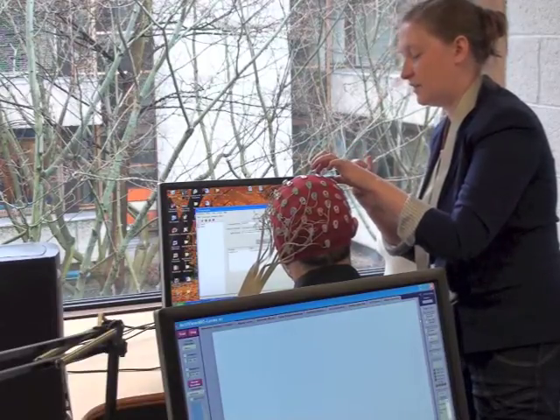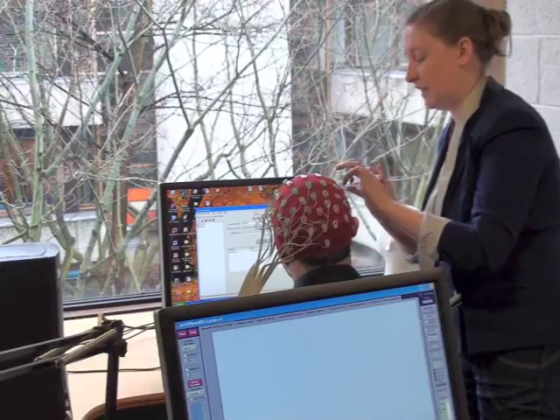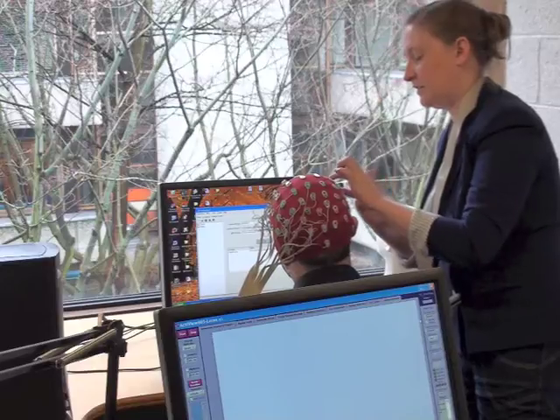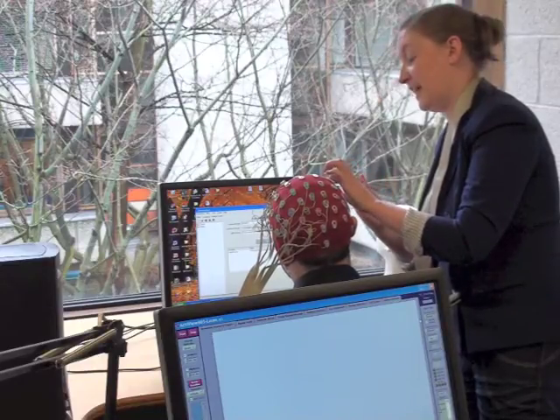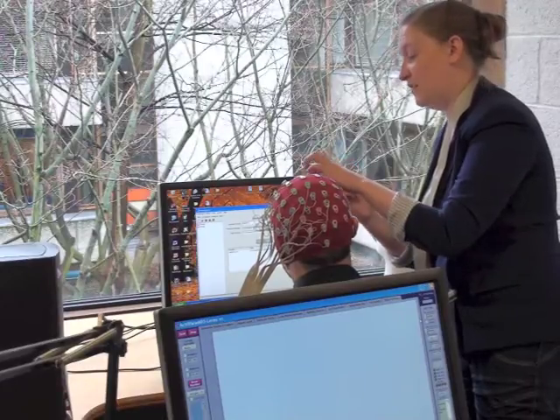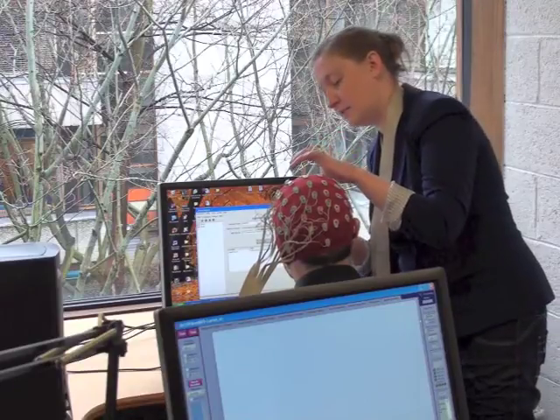Is there any value in asking the participants for feedback while you're doing that? Helen, can you feel each of those okay? Yeah. But I suppose if I wasn't familiar with it, there's no point because I'll see it now when I go to set up the program. If one isn't connecting, I'll just unplug it and put more gel in. You don't want to pressurize the participant either.